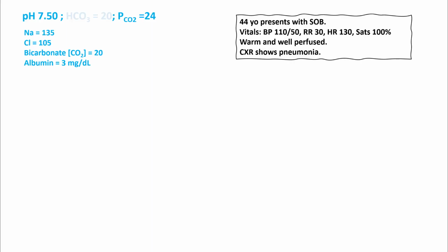So we have a 44-year-old presenting with shortness of breath. Blood pressure is 110/50, respiratory rate 30, heart rate 130. SATs are 100%. Patient is warm and well perfused, and chest X-ray shows pneumonia.